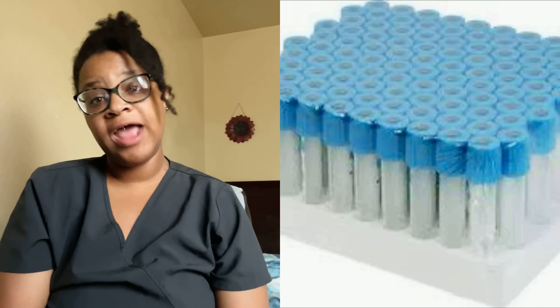The tube that comes after blood cultures is the sodium citrate — the light blue top — which is second in the order of draw. This contains sodium citrate, an anticoagulant, which acts like a blood thinner so the blood doesn't clot. The light blue top normally tests for D-dimers, PTT, and fibrinogen — it's used in coagulation studies. You have to fill it all the way to just underneath the top line; if you don't fill it enough, the lab will require a redraw.